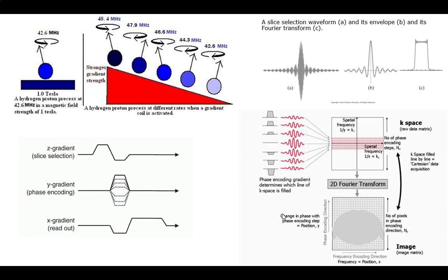Remember, the dephasing makes certain ones dephase faster, some slower. So if you set your readout when the faster ones have died out, and the slower ones haven't peaked yet, you put that to be where your measurement time is.